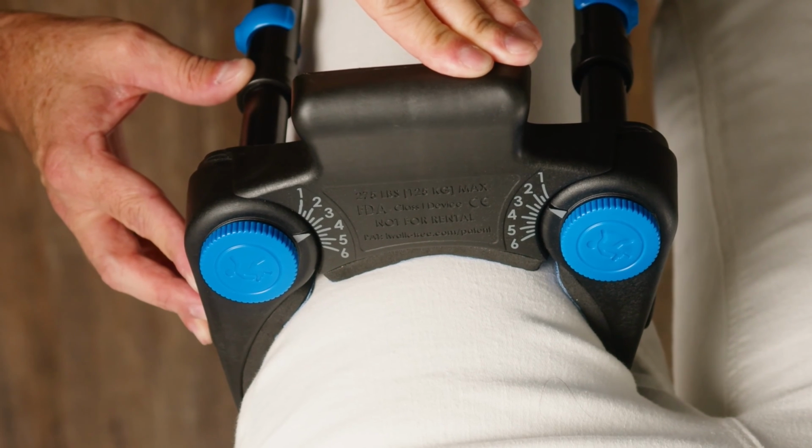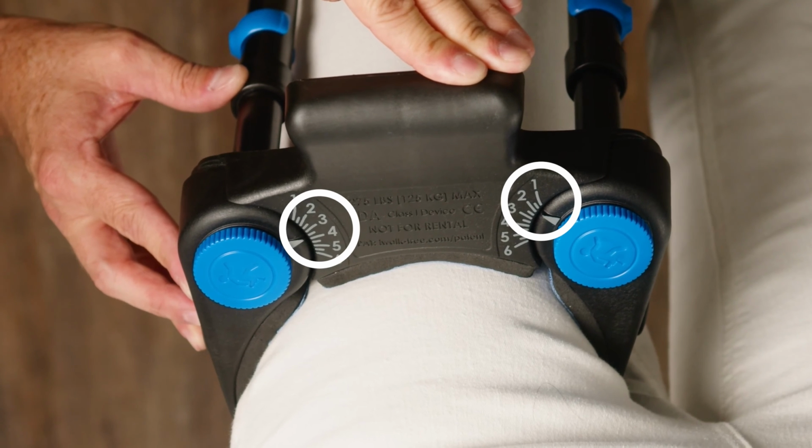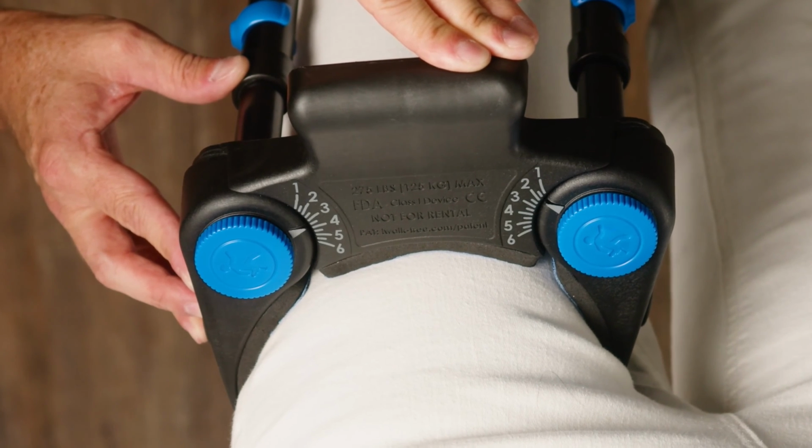Take note of the number settings. It's perfectly normal if the two sides do not match. This is how the iWALK accommodates for valgus or varus conditions.